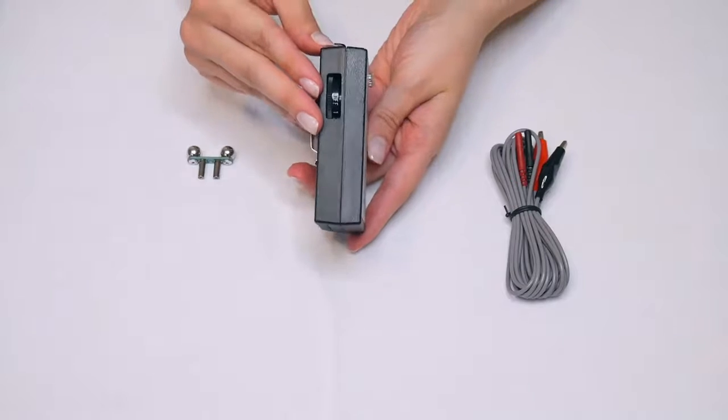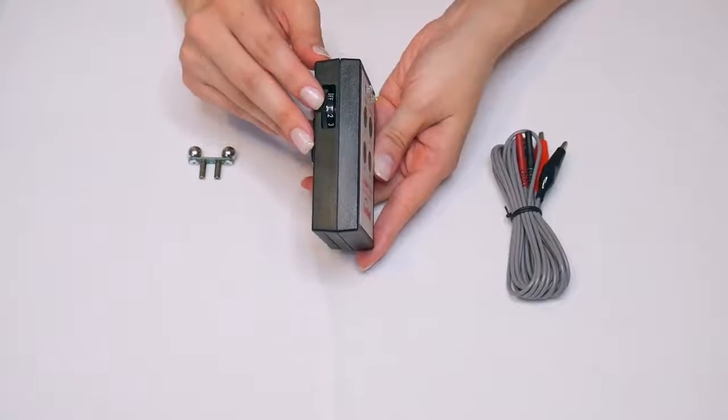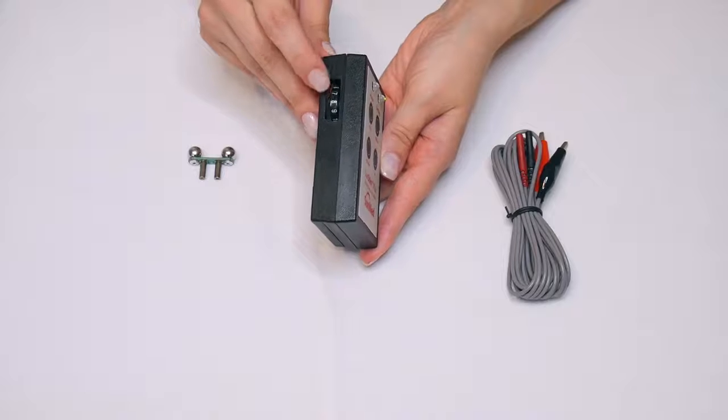On the side of the unit, you have your control knob. It is numbered from 0 to 10, and this is what you use to adjust the stimulation current, which ranges from 0 to 70 mA.